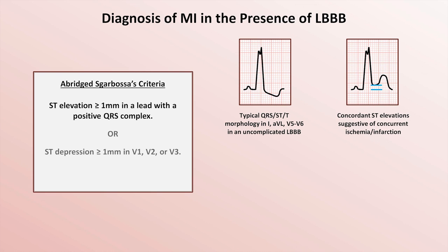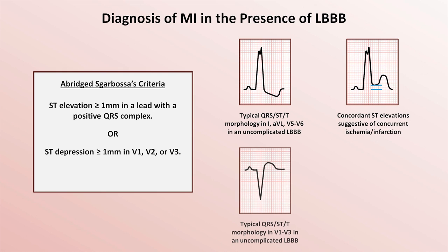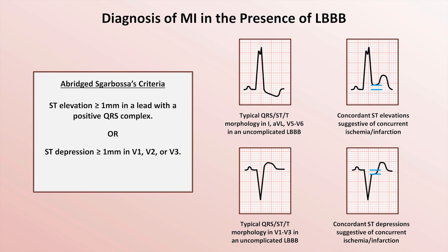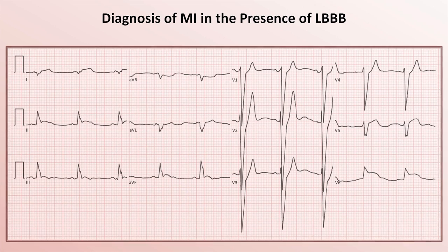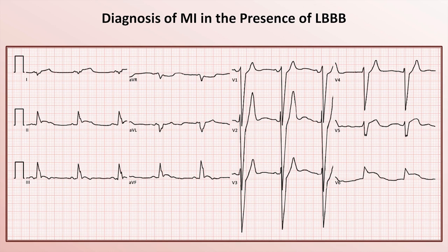The second SCARBOSA criteria is ST depressions equal to or greater than 1 mm in V1, V2, or V3. Here is a typical appearance of the QRS, ST, and T in those leads from just a left bundle, and here is the morphology suggesting an acute MI. Here is an example of a patient with a preexisting left bundle who is now experiencing an acute MI. You can notice the concordant ST elevations most prominently in leads 2 and V6, and the concordant ST depressions in V1 through V3.